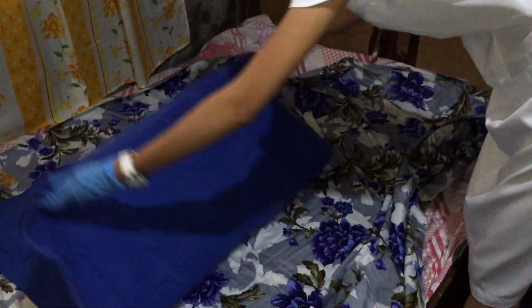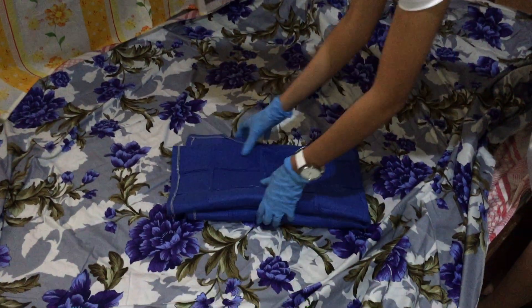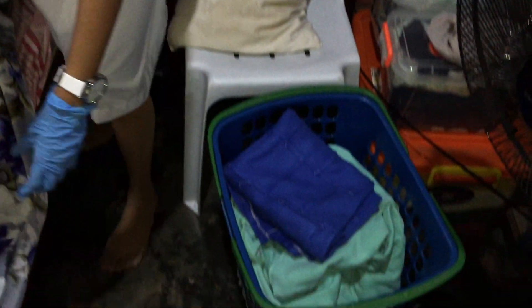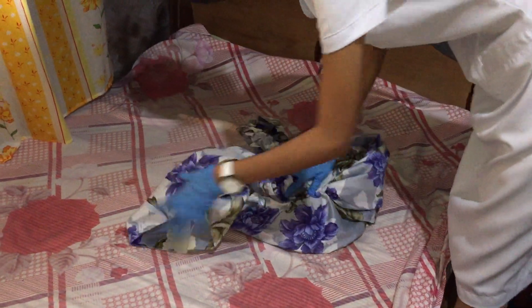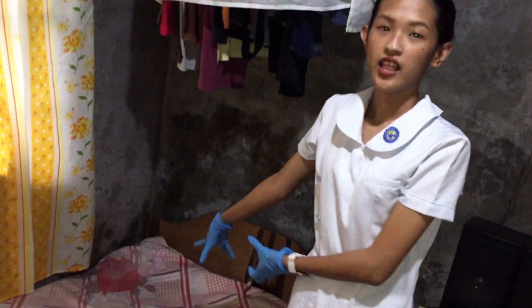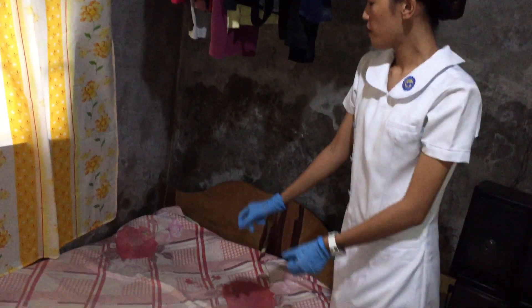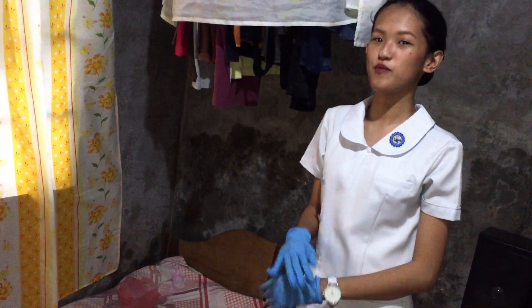Next is to remove the waterproof pad if it is soiled and put it on the hamper. Lastly, grab the mattress with a lug if present and move the mattress to the top of the bed if it will not be used for a set time.